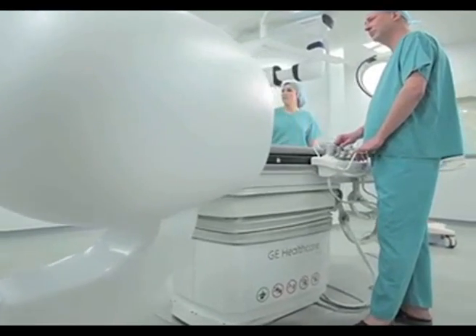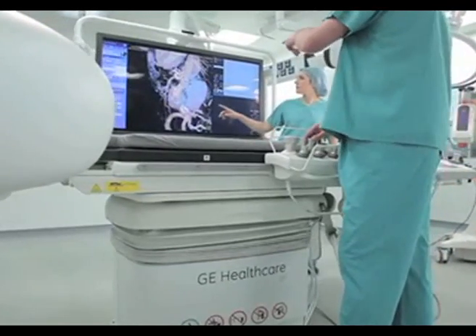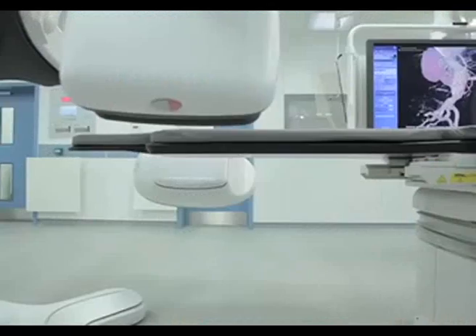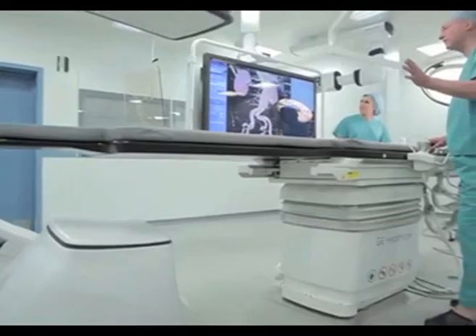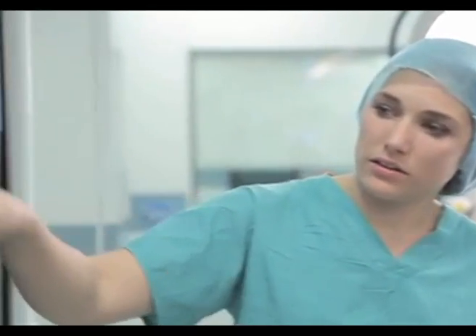This new technology lends itself to be used for navigation, because these images can be overlaid to the patient, and that makes it possible then to move the catheters and guide wires through the patient without having to give further contrast. These images have to be created each time on the table, and that means you have to give more contrast, and that way you lose the advantage you would have using these techniques.